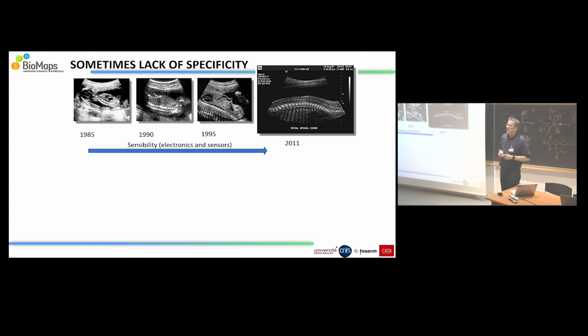Yes? It's a great question, and maybe to build on that, what if you have a patient with myocardial infarction where you have a small occlusion of one of the coronary arteries? Could you use that in the distal and proximal segments of the coronary arteries and measure the blood flow? I think you cannot use a classical Doppler.